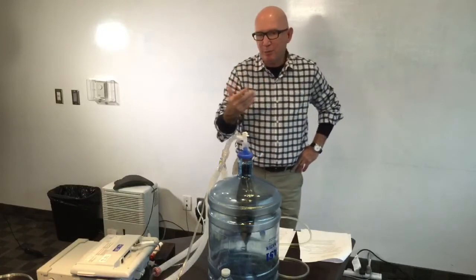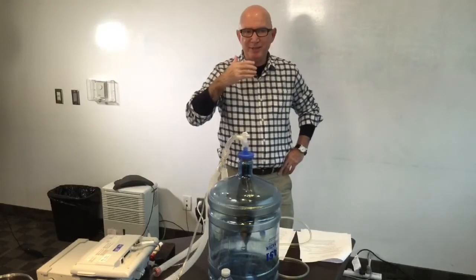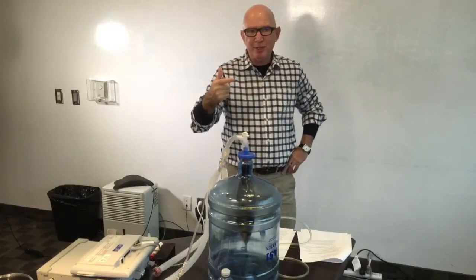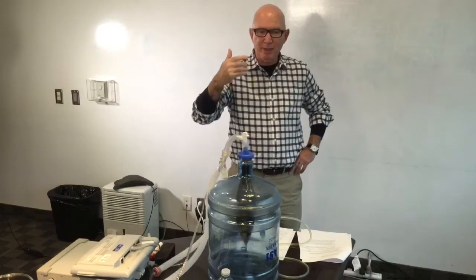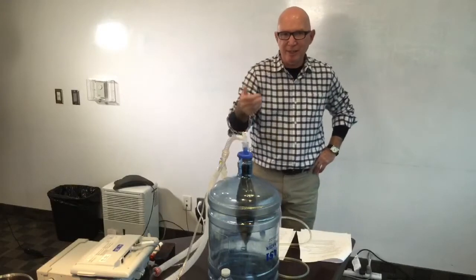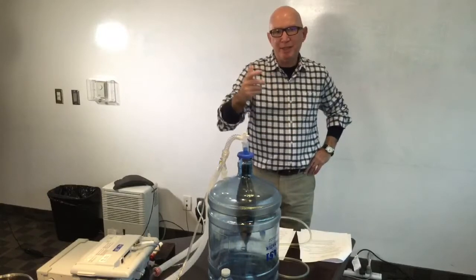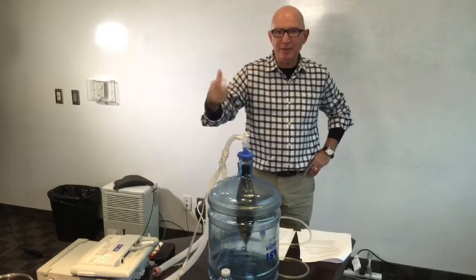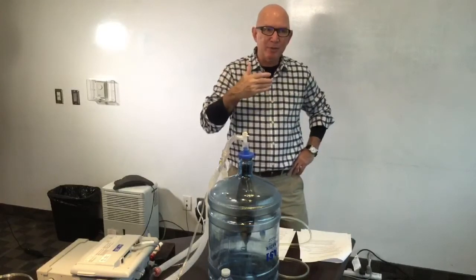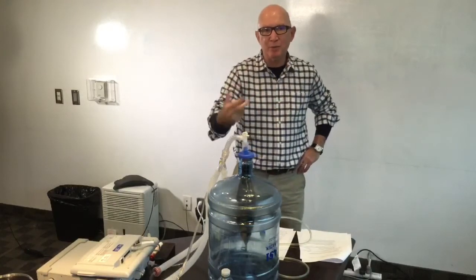And the nice thing about pressure support ventilation is that if a patient has an intact respiratory drive, and assuming that it hasn't been sedated right out of them, or you haven't paralyzed them, then that respiratory drive, if it's an appropriate drive, will establish the right respiratory rate based on the tidal volume that you're giving the patient with the ventilator to manage their acid-base balance and their oxygenation. So you're letting the patient cycle the machine, triggering every single breath. They're all pressure-supported breaths, and you can titrate your pressure support levels as high as you want to take most of the work away from the patient, or as little as we want so that they do some of the work.